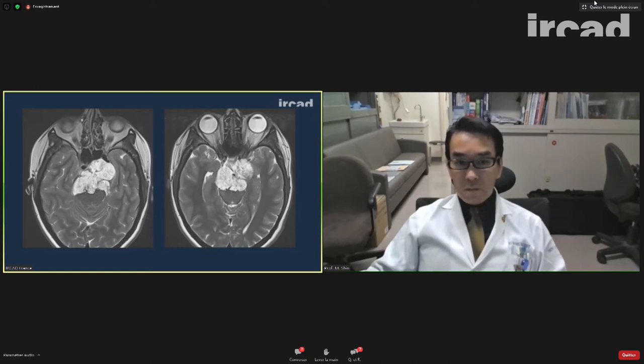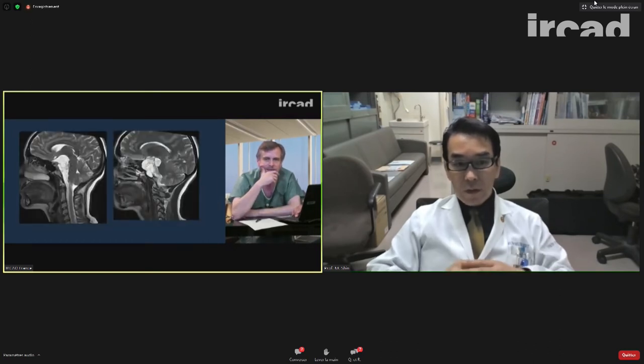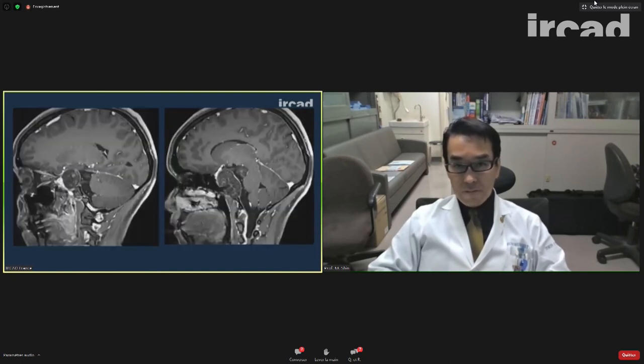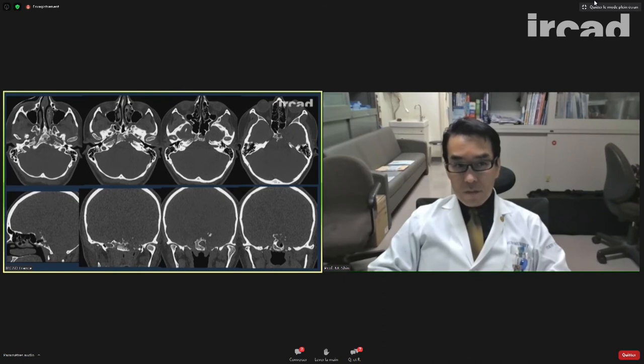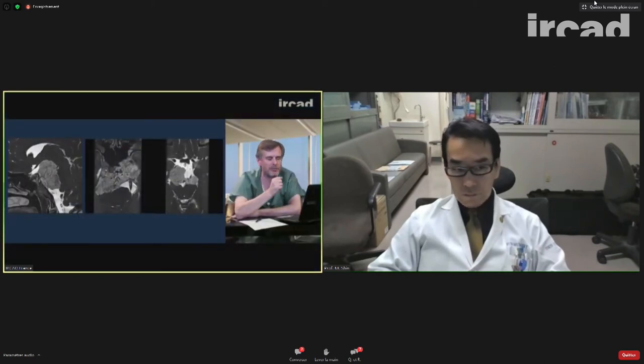Yeah. So I will show you the video of it, but your arguments are absolutely good, because you have first the technique and this different access of the skull base, and secondly you have this strategy for closure, which I believe is very nice. Here, you can see the superior aspect of the tumor on the right, indicating that there was probably a tight relationship between the tumor, the PCOM, third nerve, PCA, and eventually some perforator. So this was the thing I was worried about.